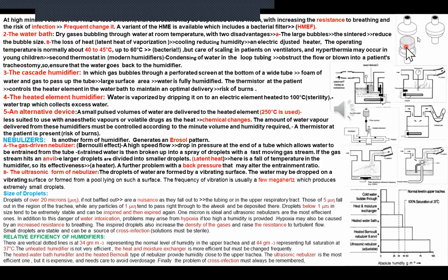What happens with this method? Whenever this is attached to the expiratory limb, of course, when the gases are coming out, it induces condensation on it. Whenever there is condensation, there will be a release of heat. You see, as we have condensation, the gas is being transferred to liquid, and we have the latent heat of condensation. These two things will be added to the next inspiration, so that the patient will inspire gas where there is humidity and it is hot enough for him.